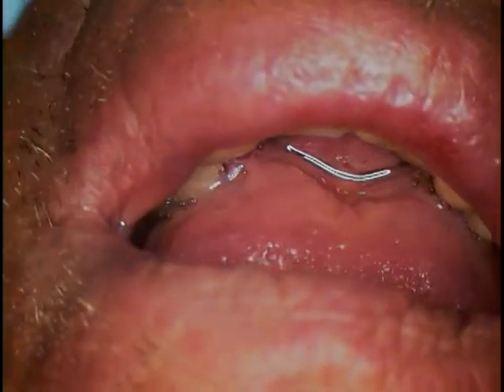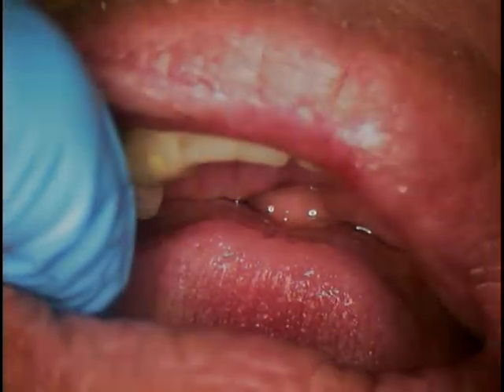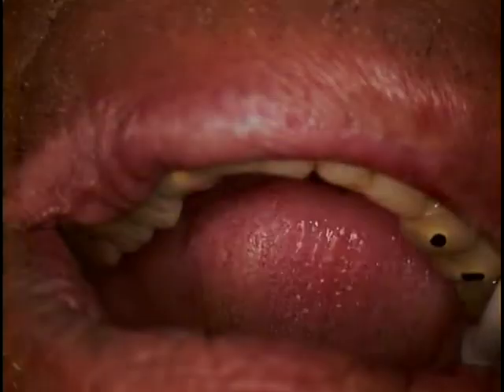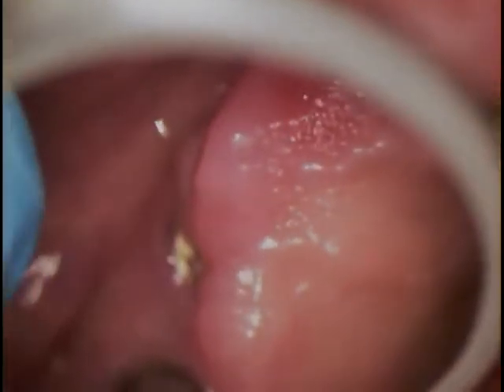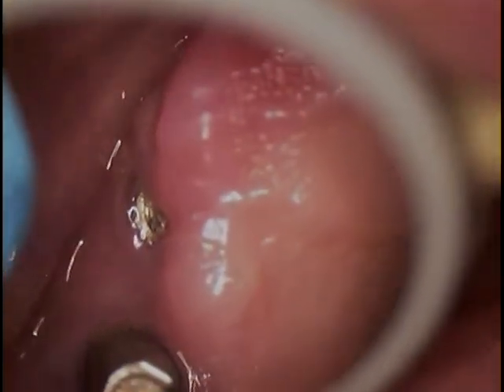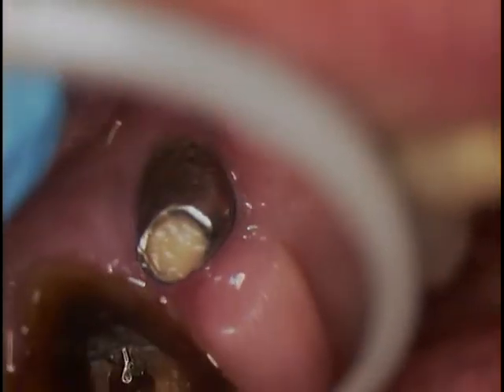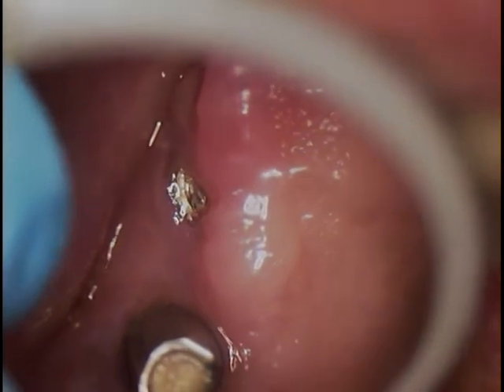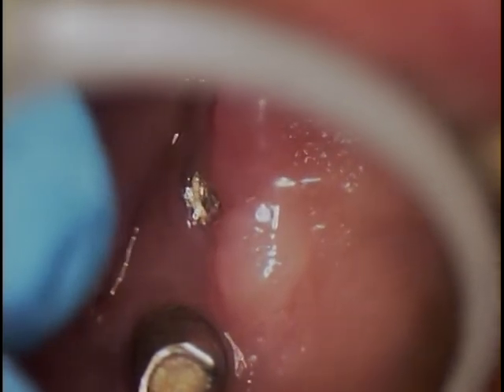We're going to insert a little dry angle and put that in place. There's our implants. You can see one of them is peeking out to the labial aspect, so it has a little window or fenestration, and we can actually see that portion.